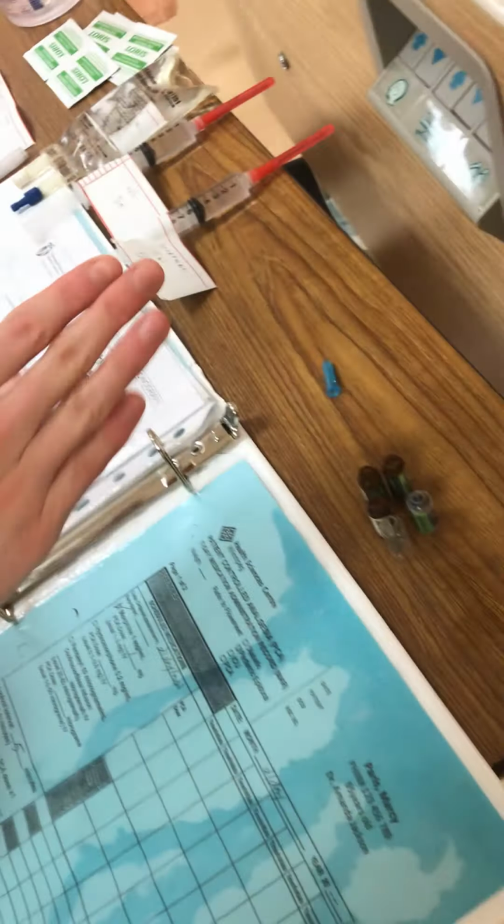So here is the morphine. I am now ready for my second check. With my second check, I will grab my second nurse after this check so she can sign the signature. I'll be doing my second check with the MAR, with the parenteral drug monograph, with the label that I have made, with my medication that I've drawn, and with my medication right here.